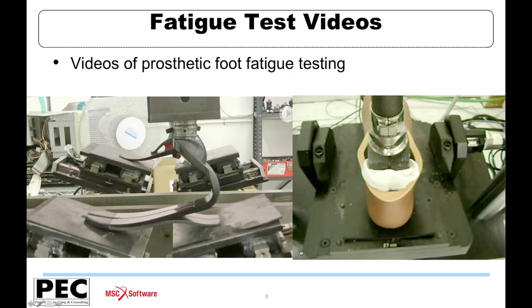So two different aspects, and it can be very, very difficult to get a fatigue test that is relevant, severe enough without being too severe. These are also one of the challenges that designers of prosthetics face in evaluating the designs.